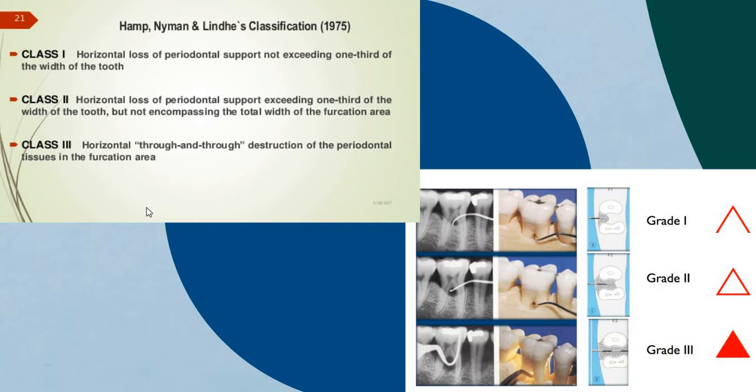We talked about simply in the basic periodontal examination, we talked about the asterisk symbol of the furcation involvement. Here we are talking about the classes of furcation involvement. A curved explorer is used to determine the topography of the furcation involvement, and this kind of probe is named Nabers probe. It will allow the accurate classification into 3 groups or 3 classes or 3 grades.